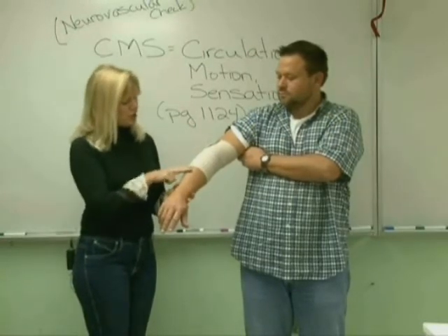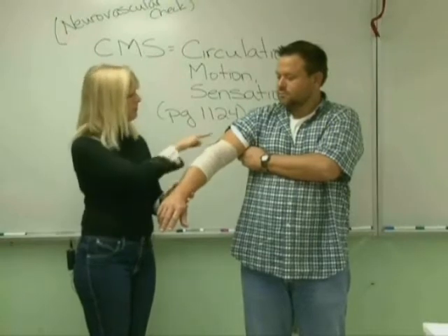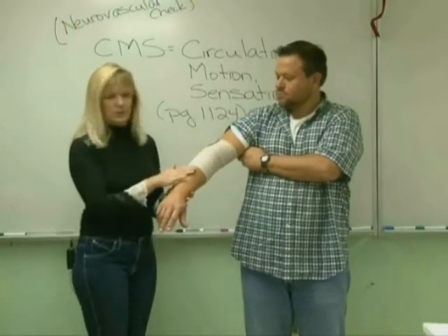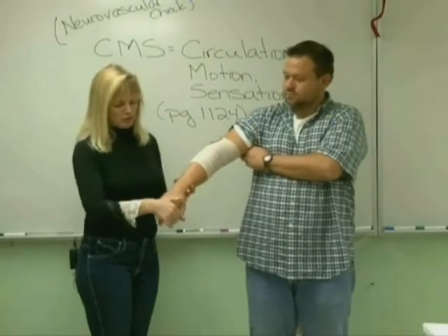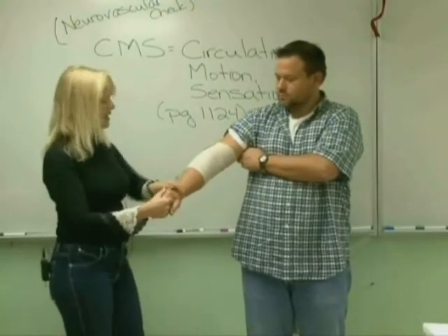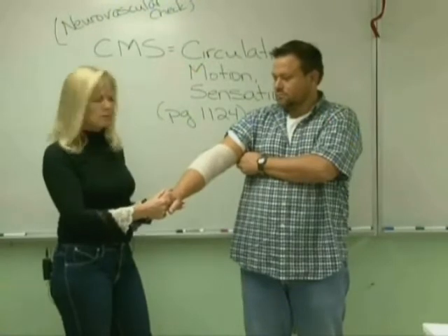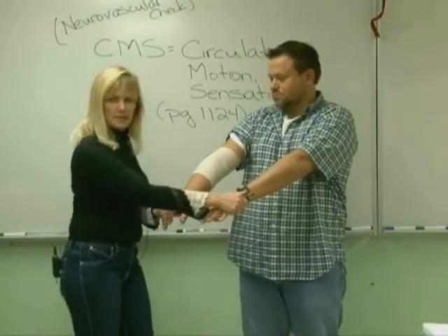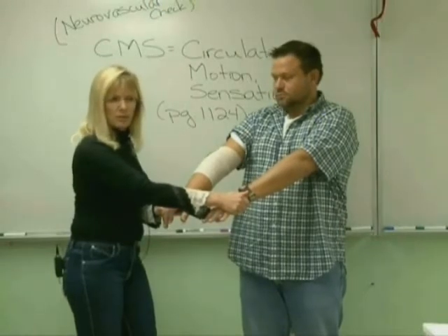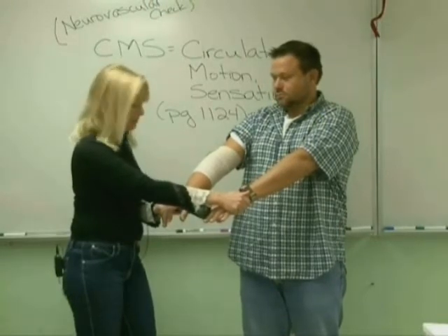First we're going to check for edema or swelling anywhere around the edges of the wrap — and there is none. Then we're going to check the temperature of the area distal to the wrap, and it feels a little warm. So I'm a little concerned. I'll feel the opposite extremity, and that feels warm too, so they're comparable — that would be normal for him.